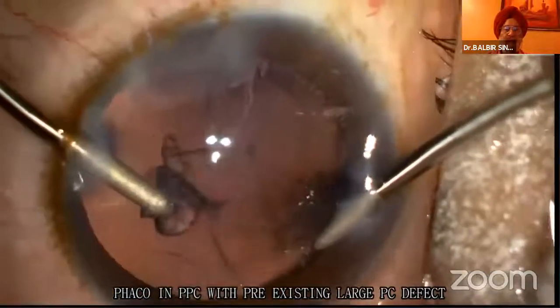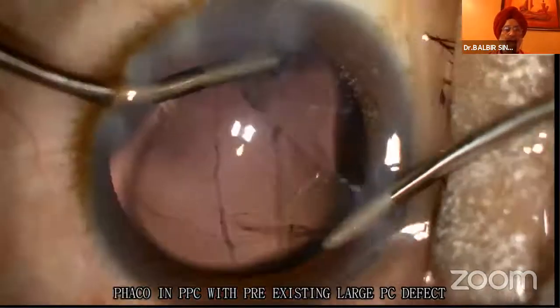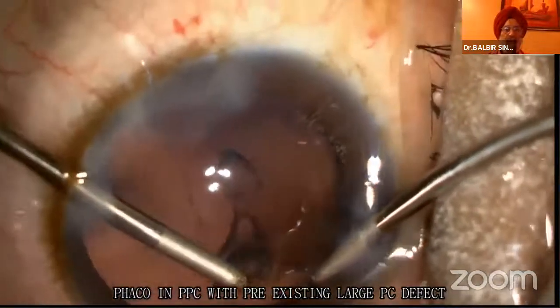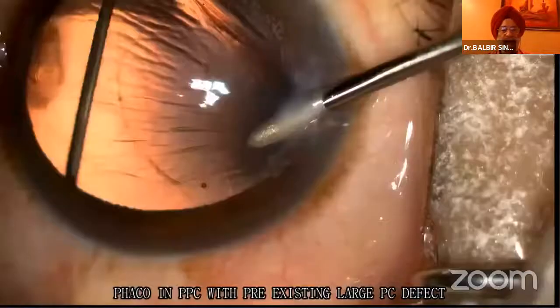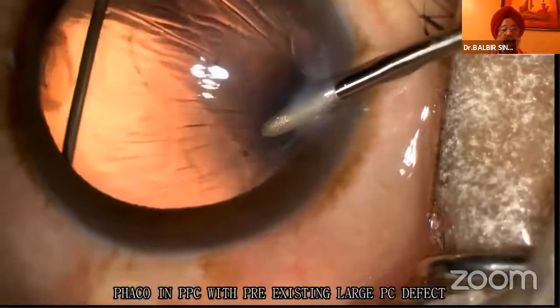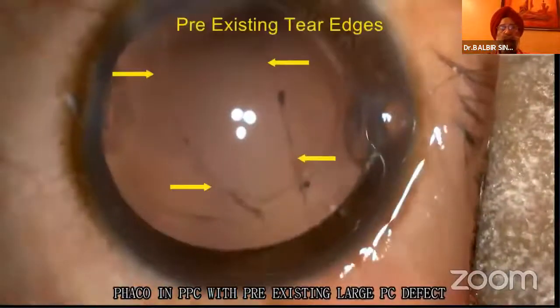Now I am inflating the bag, and these were the pre-existing tear edges, which have now been confirmed post-operatively.